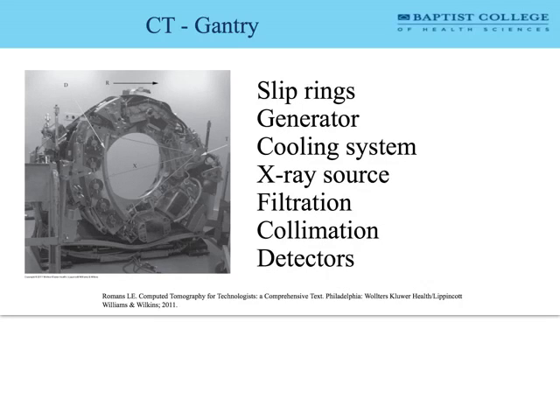They're important to think about, and largely, again, what they're going to allow us to do is continuously have power going through the x-ray tube. So we need a generator on board. So top of page 16 in our textbook, it talks about how the generators produce a high voltage and transmit it to the x-ray tube. That's basically what the generators do. You want to be very careful around this thing. You don't need to be drinking your giant big gulp around it, because it does have a very powerful generator inside the room.